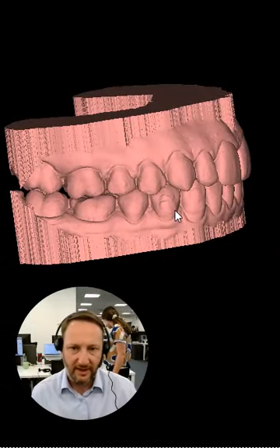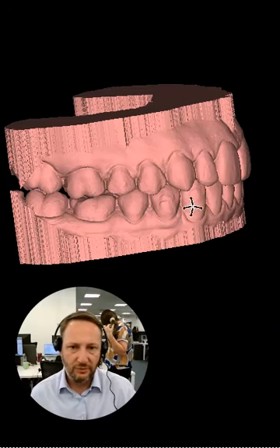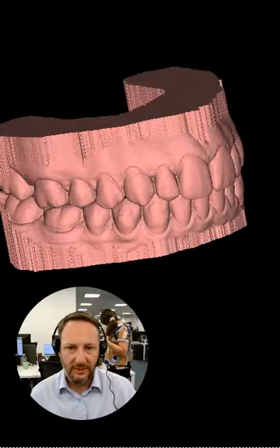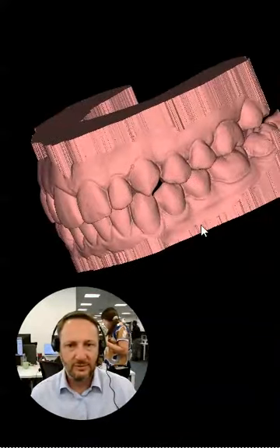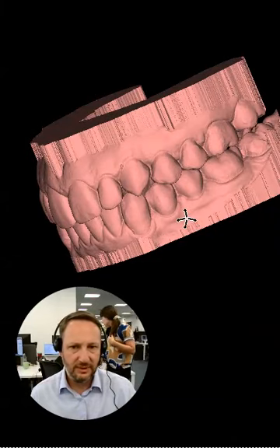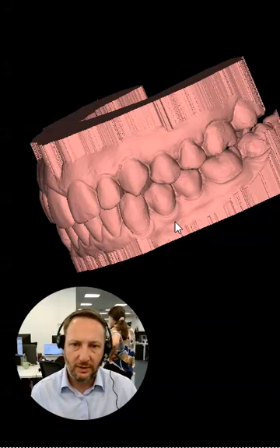just respecting the airway aspects and the face aspects, we could allow the lower jaw to move forward and bring her to this great intercuspation. We still need to do some minor fine tunings with an additional set of aligners, but she's now a class 1 patient, only with this functional movement of the lower jaw.